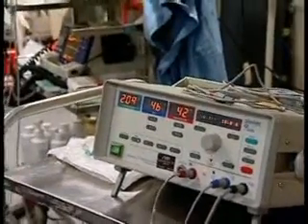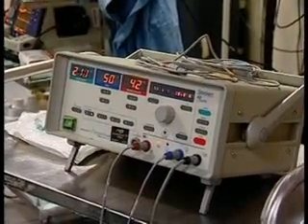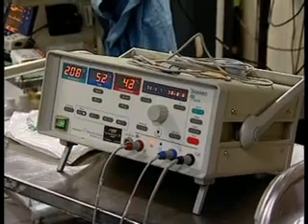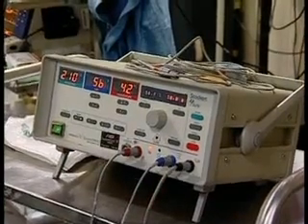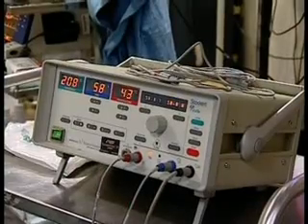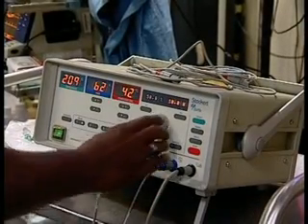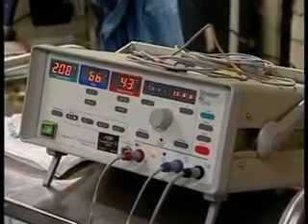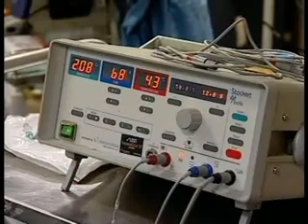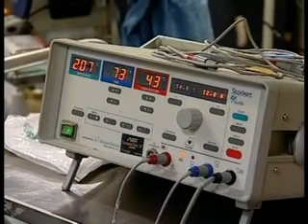You can see this is a sufficient drop in impedance. From 220 it has dropped to around 210 now, and we have titrated the power to achieve this. We started with 8 watts, we have stepped it up to 10 watts now. Go to 12. You are going from distal to proximal, right? That's right, that's right. Each area we deliver 90 to 120 seconds of RF.